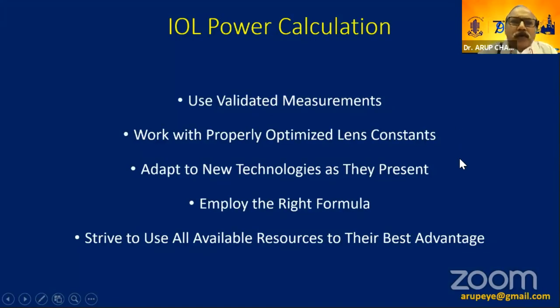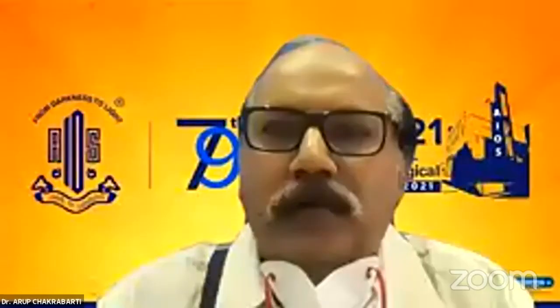So friends, in conclusion, I'd like to say that use validated measurements, work with properly optimized lens constants, adapt to new technologies as they present, employ the right formula, and strive to use all available resources to the best advantage. Thank you very much for your kind attention.